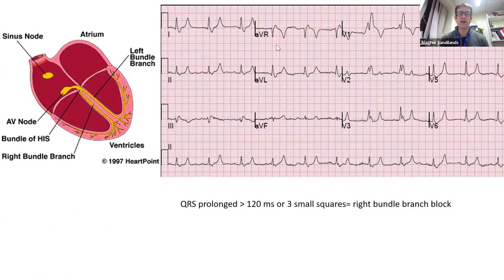Someone's written something in the chat. Is there also left axis deviation, or is the axis normal? Oh, what was that ECG? Sorry, I answered it earlier. No worries, thank you. It's really hard for me to keep up with the chat as well. It doesn't come down on my screen.